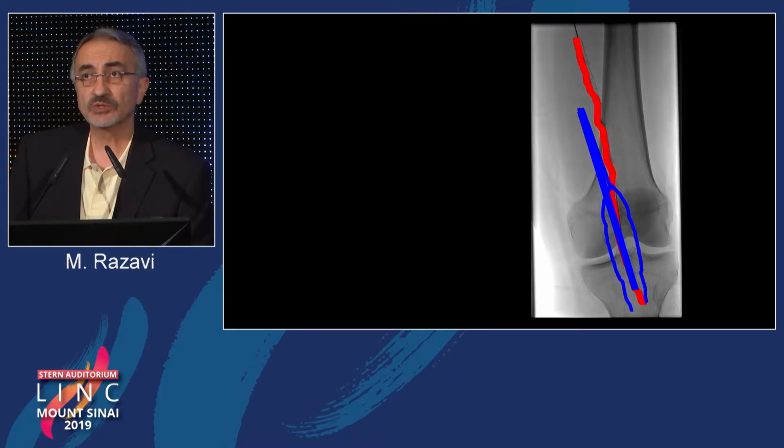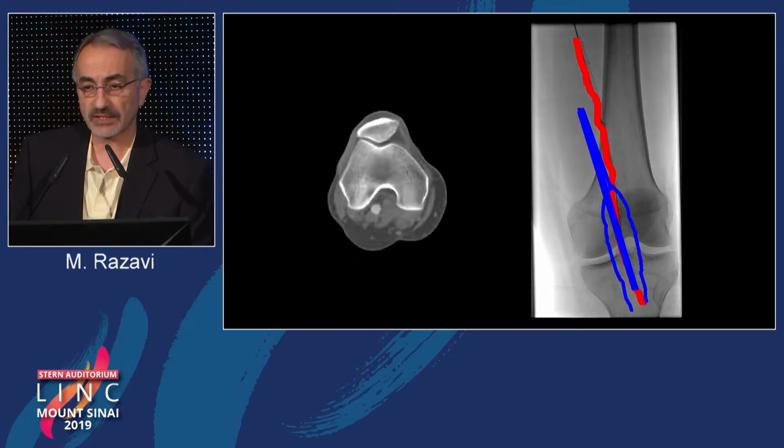When we go distal SFA access, as you just saw Andre do, we typically use an anteromedial approach. That usually avoids all these structures. Here's a CT scan, here's the artery, here's the vein. Sometimes these veins are duplicated on both sides. So if you're truly going popliteal, there is no way to come anteriorly from it. You have to go posterior. You really don't need to, because you can access this vessel in this location.